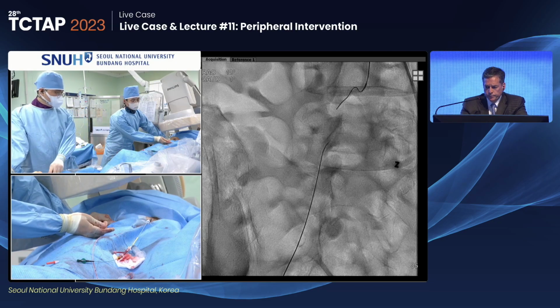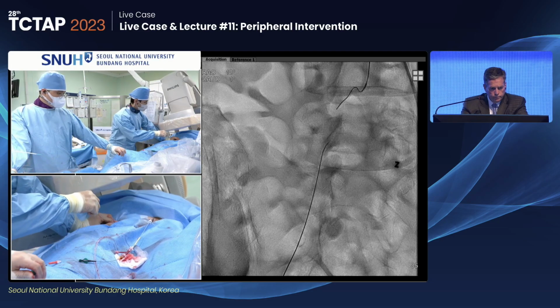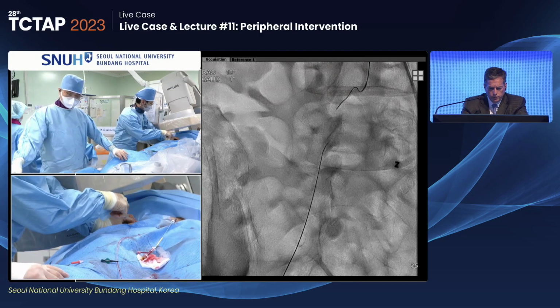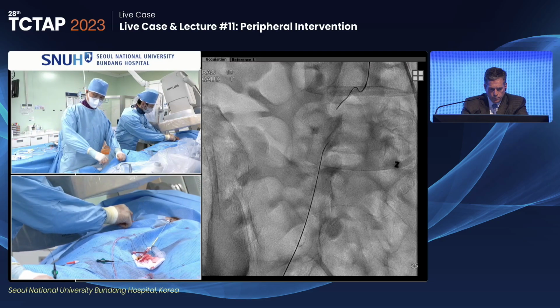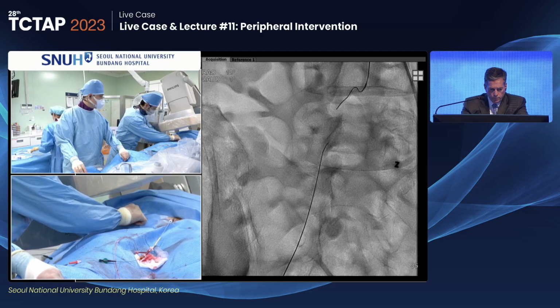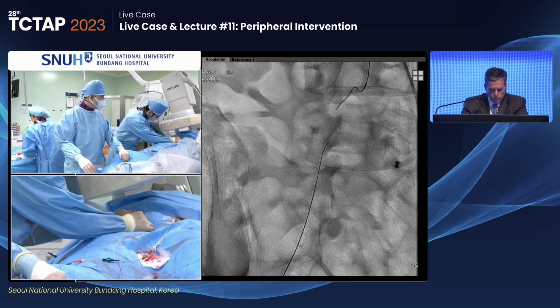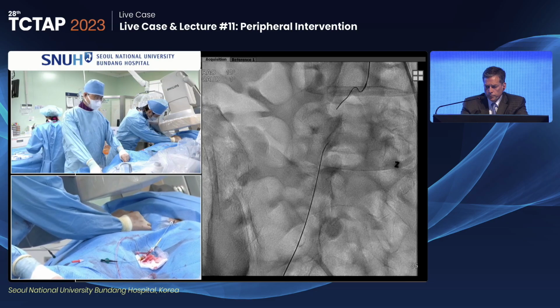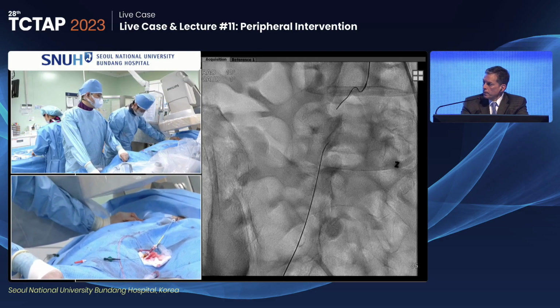During the sheath insertion, the dilator was 018, but the wire inside is 014. So there was a kink inside the vessel, and now I had difficulty. Yeah, it's a little problematic trying to bring a sheath in over an 014 wire in the groin.